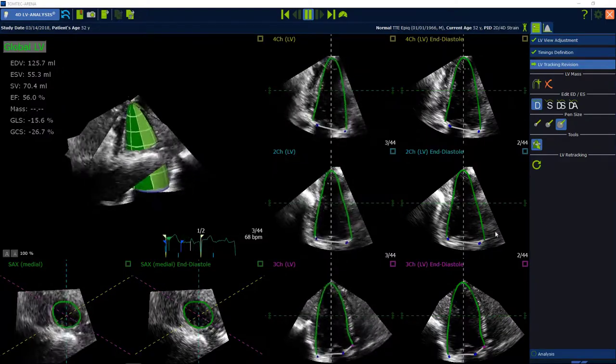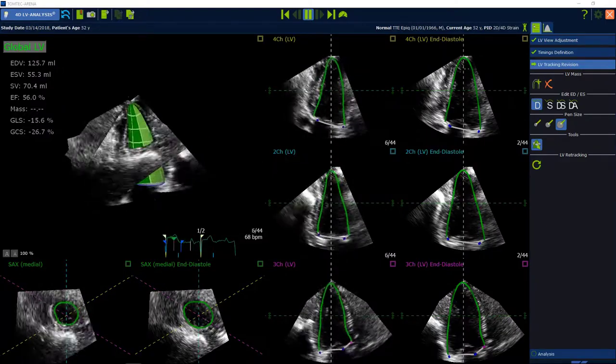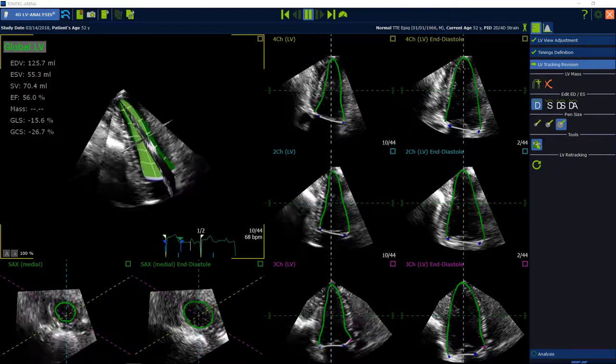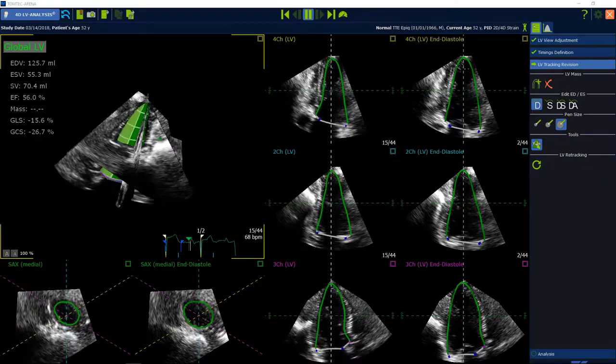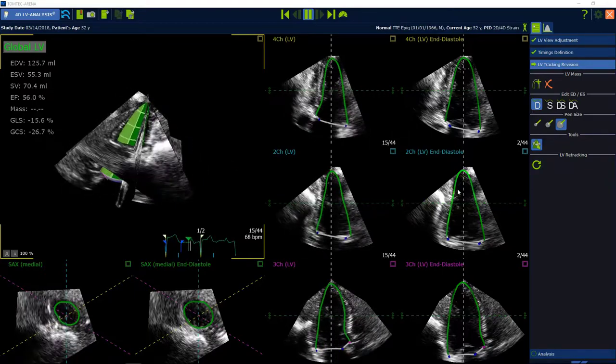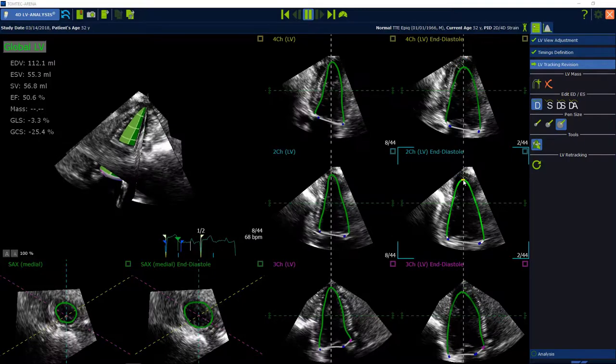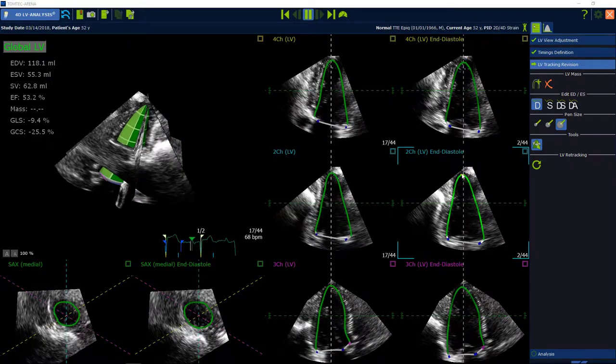The left ventricle surface model is created automatically. Make sure to have a precise contour and end diastolic phase. Adjust the proposed contour by drag and drop in the static images if necessary.